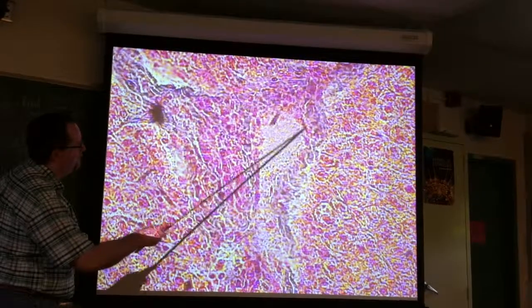Right there is where I'm going to be looking. It's not looking promising. Yeah, not good. Not good. There is one structure here that's kind of occluded in the lumen. It appears to be a branch of the hepatic portal vein, but because you guys haven't seen these liver slides before, it's difficult for you to tell.